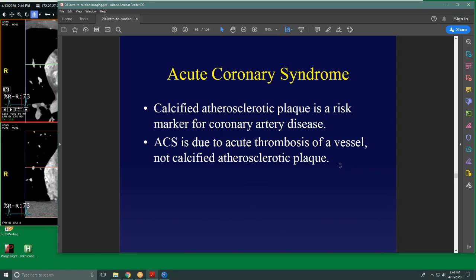And calcified plaque, this is interesting. We often use, you guys heard of coronary calcium scoring? Let's get a yes or no. Okay, so generally speaking, a higher coronary calcium score is considered bad. Interestingly, though, that's stable plaque.